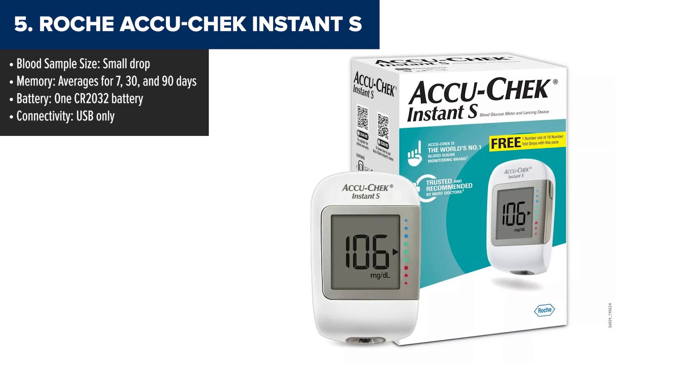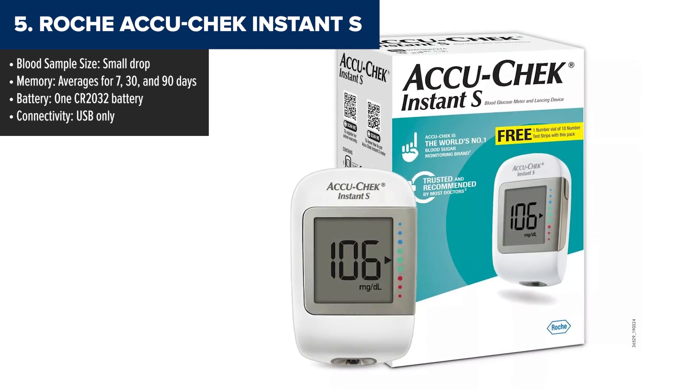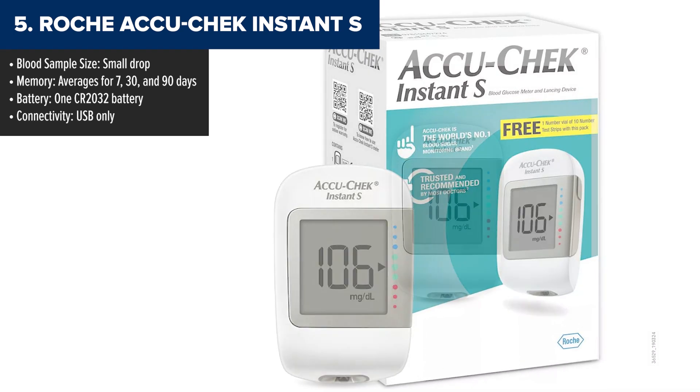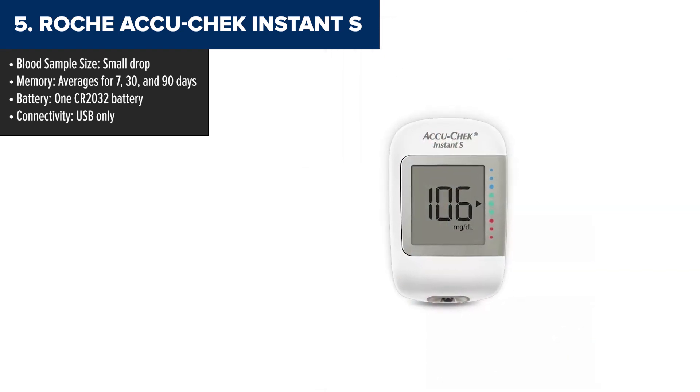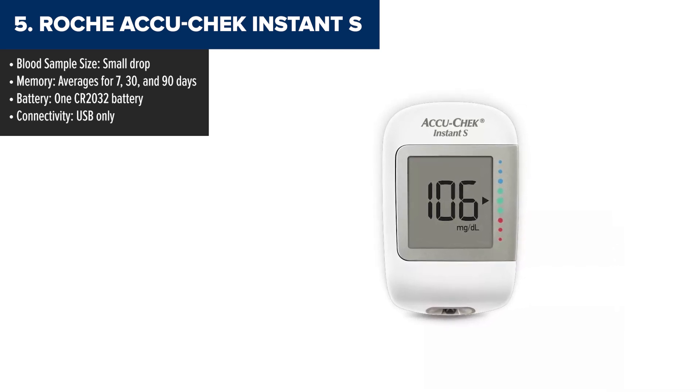Coming in at number 5, we have the Roche AccuCheck Instant S. Now don't get me wrong, this is a reliable and beginner-friendly option. If you're someone who doesn't want to mess with complicated setups or extra features, this one might feel like a breath of fresh air. It's straightforward, easy to use, and gets the job done.